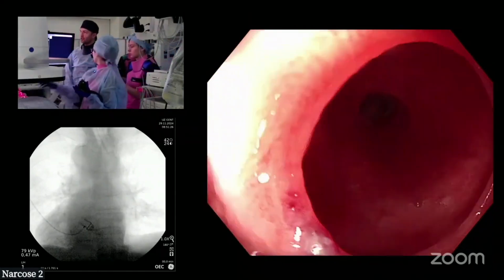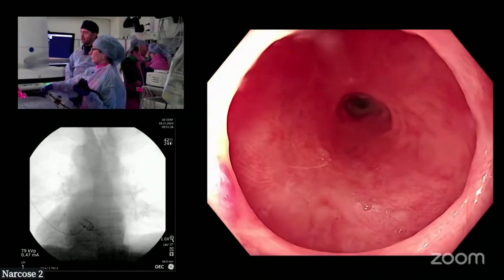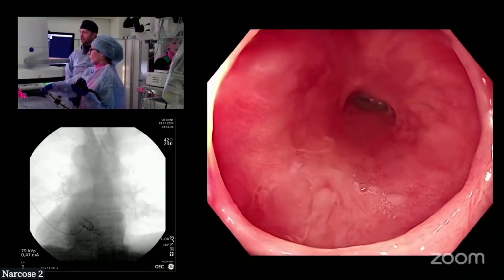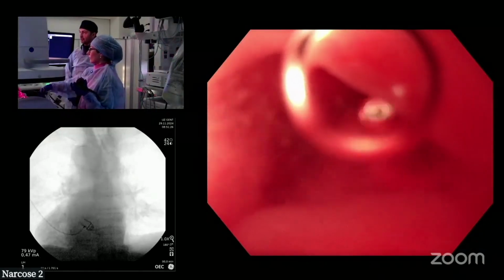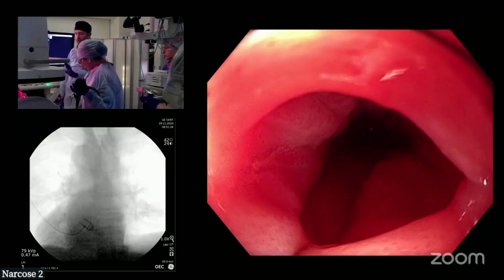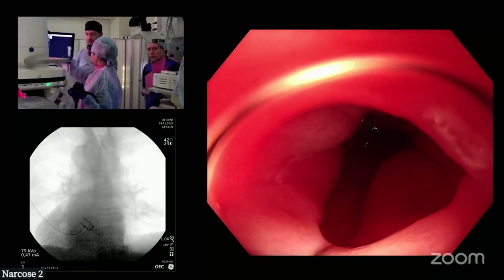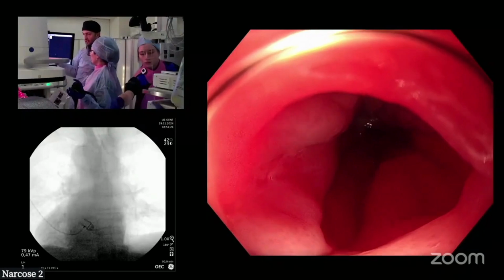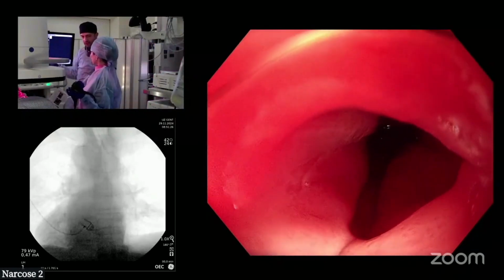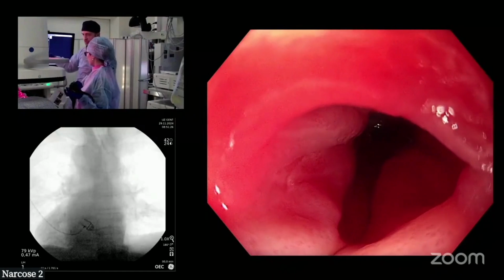Okay, so suction the lumen a bit before you do that, because we don't want the whole lumen really open. We're really interested in the second one, not the first one. So you can sit your endoscope here. Okay. Now, you need a control shot. What is a control shot? To see that it's in the right position. Yeah, also, because if you're having any leaking or any problem later, you want a shot which shows the normal situation, and you just want one tap, right?